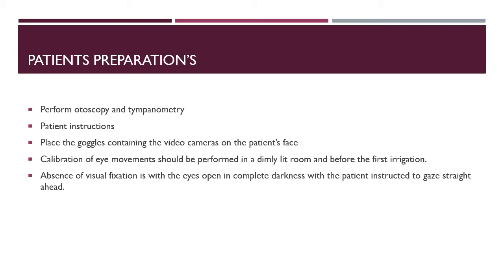We must explain to the patient that the test will involve warming and cooling the external ear canal, and that this may or may not result in dizziness, which lasts about 1 to 2 minutes. We also must explain to the patient that any dizziness experienced is a normal reaction, and that the test is not intended to provoke an episode of their own dizziness. Then we must obtain verbal consent to proceed with the test.